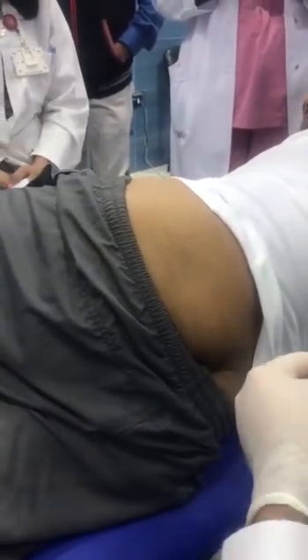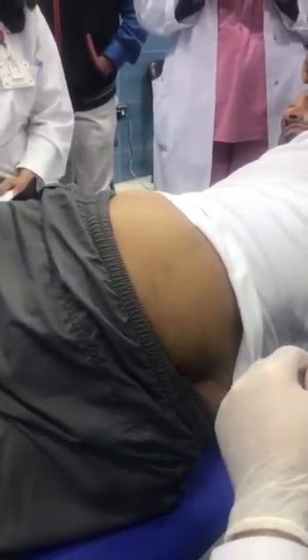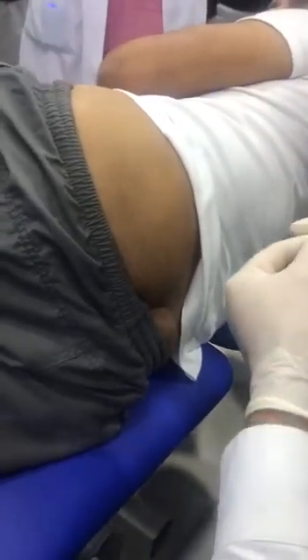My main concern here is that the patient doesn't refer any electrical feeling. I don't know if in your experience these months, when you tell the patient that there is some risk and if you feel any electricity, sometimes even a twitch reproduces something like an electrical activity, the patient is very afraid and says, no, electricity. So sometimes the question is, if I'm just inserting and feeling a twitch, perhaps this can be a bit electrical, but I can confirm that this is a trigger point. Sometimes it may be a bit difficult for some patients.